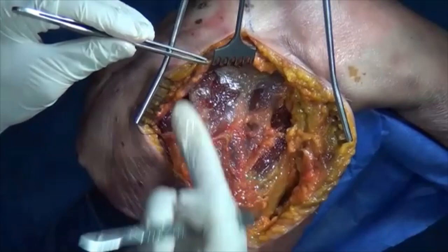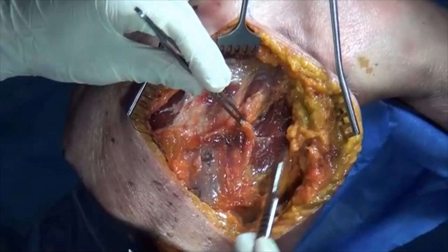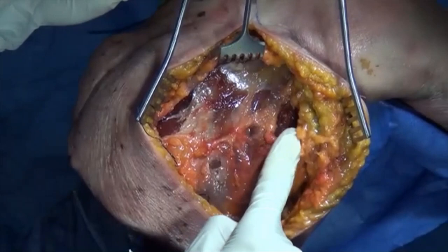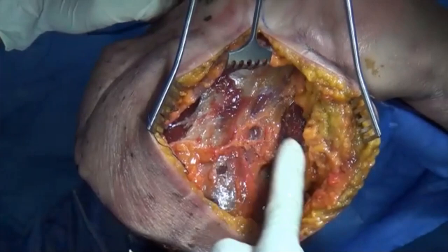Once the deltoid margin is clear, you can do blunt dissection to lift it off. Then identify your anatomy: the infraspinatus, the teres minor, and the pedicle between the major and minor. Another trick — if you're unsure which muscle is which — follow the muscle up to its insertion: if it goes to the head of the humerus, it's teres minor; if it goes to the shaft, it's teres major. That's the main landmark trick in this approach.